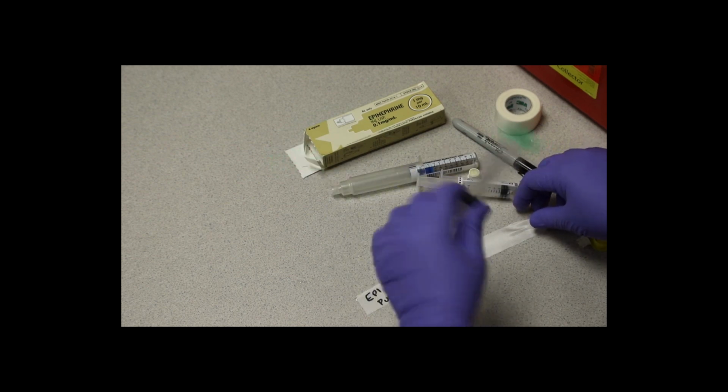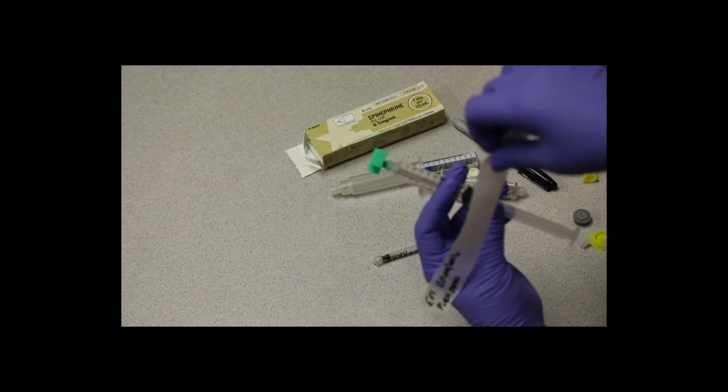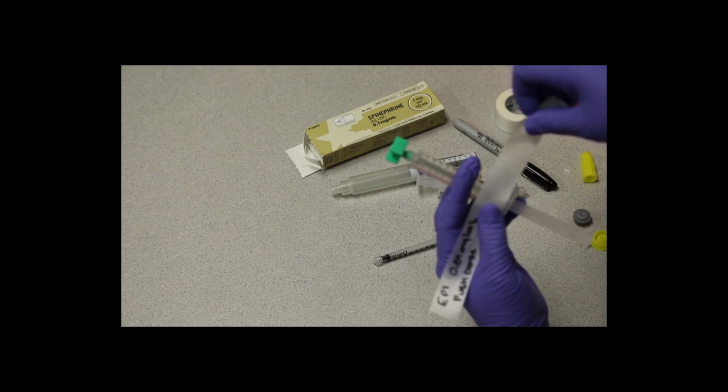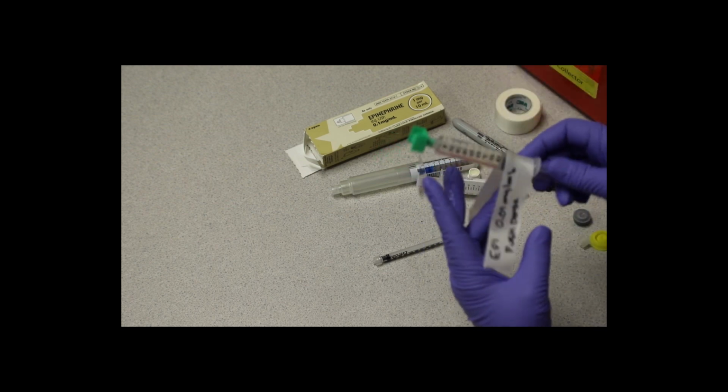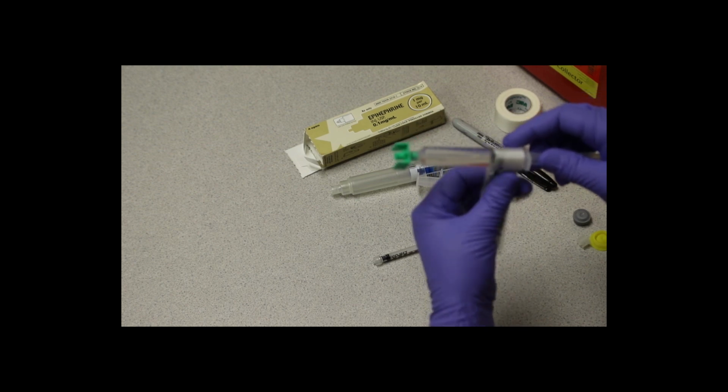You're going to shake that to blend it a little bit, and then make sure you put a label on it. You certainly wouldn't want somebody to confuse this with saline and give it by mistake, so you definitely want to label it.